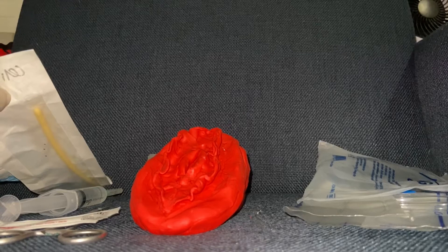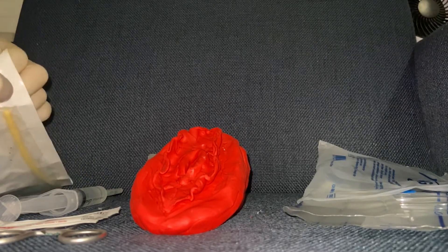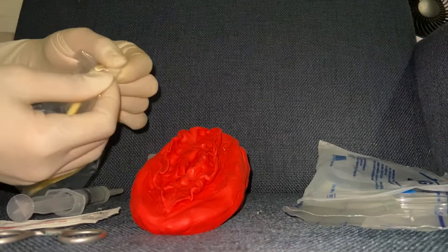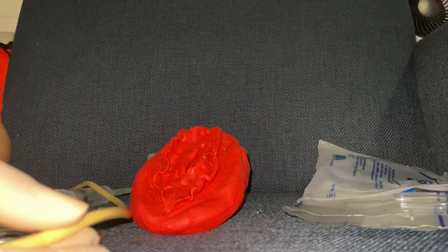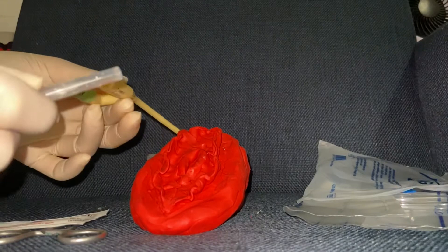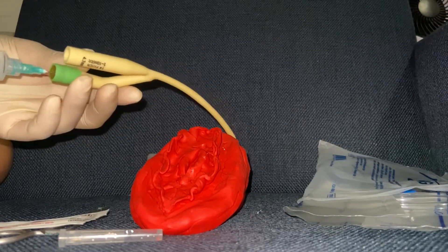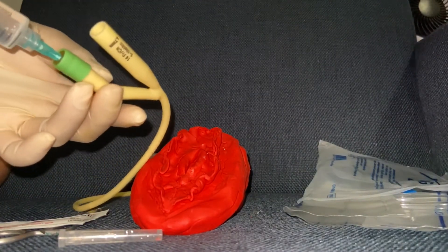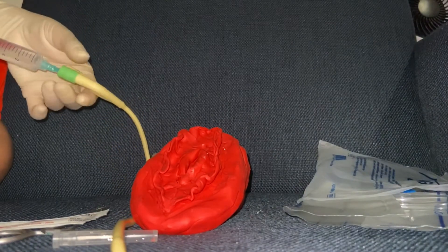Now let's start. Open the catheter package. Get your 10cc syringe and then inflate the balloon with the pre-filled syringe to check if your catheter is defective or not.